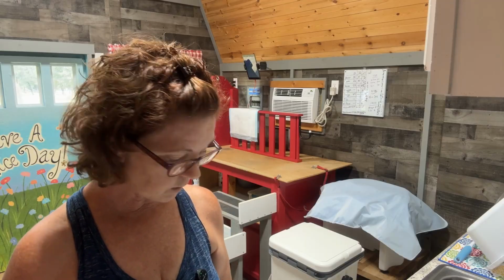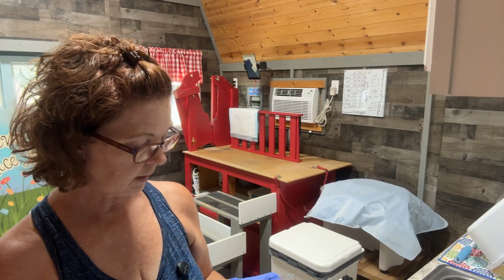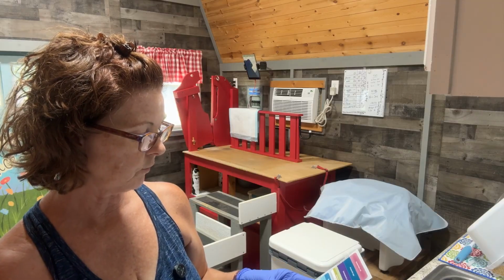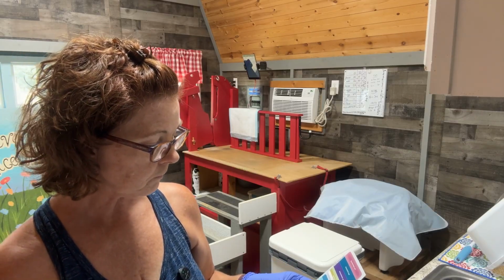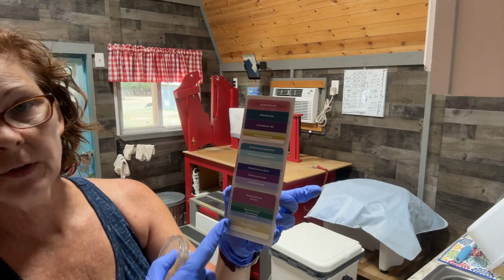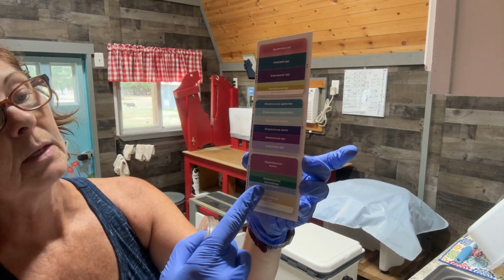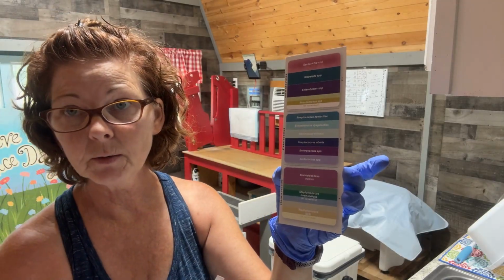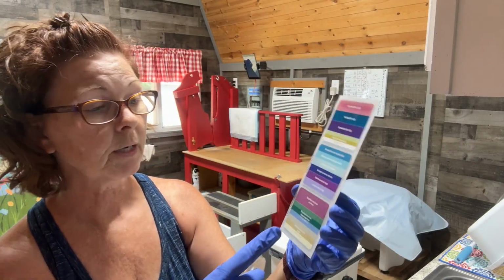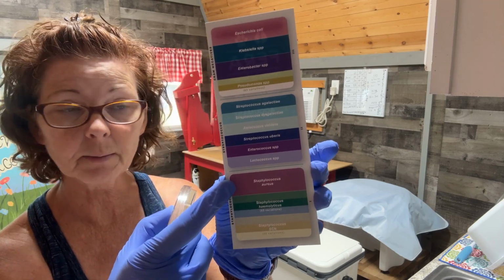So what I would have done if there had been some change in color is I would have matched my section with the single dash. That is testing for staph species. And I could have matched this to see which specific staph species I was dealing with. And the cool thing about this is the big monster that anyone who has dairy animals worries about is Staph aureus. This test does test for Staph aureus, which is really fabulous.